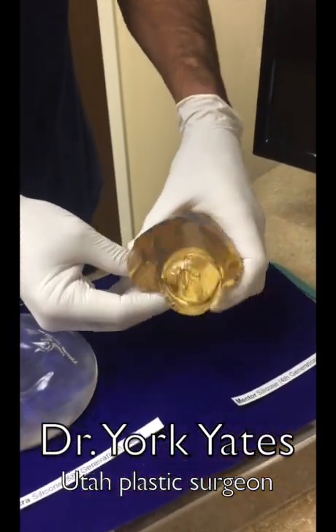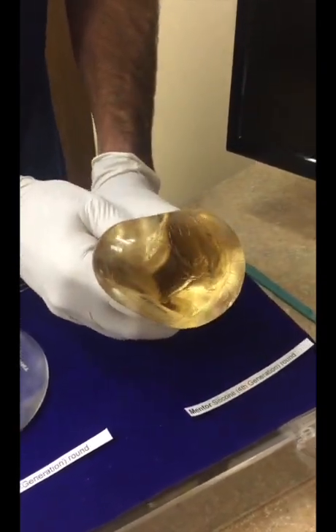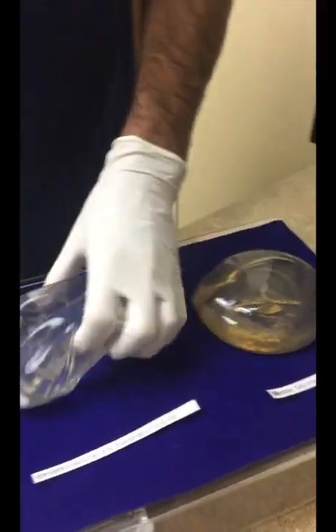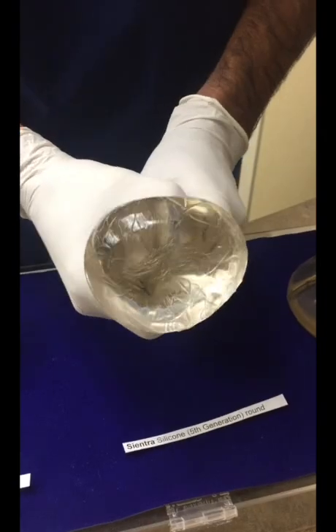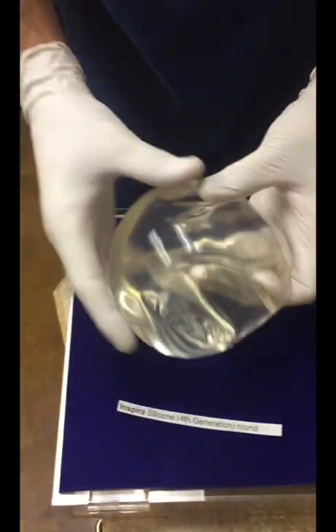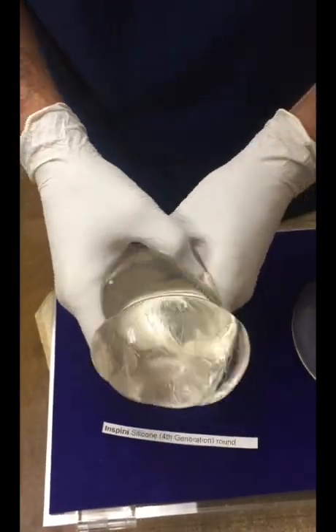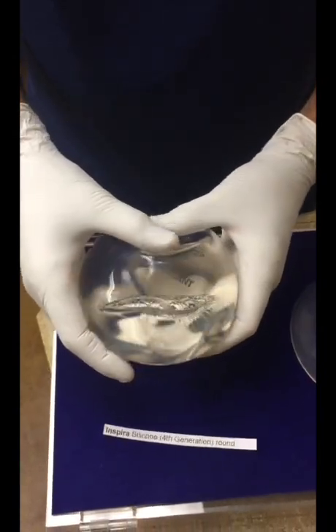The Mentor implant is the least cohesive of these, so as we squeeze it — what happens? It still comes back within the material. As we get more and more cohesive, here's the Sientra implant, which is actually more cohesive than either of those other two. Squeeze it out, and back it comes. And the Inspira implant — it's somewhere about as cohesive as the Mentor implant. Squeeze it out, and back it comes.